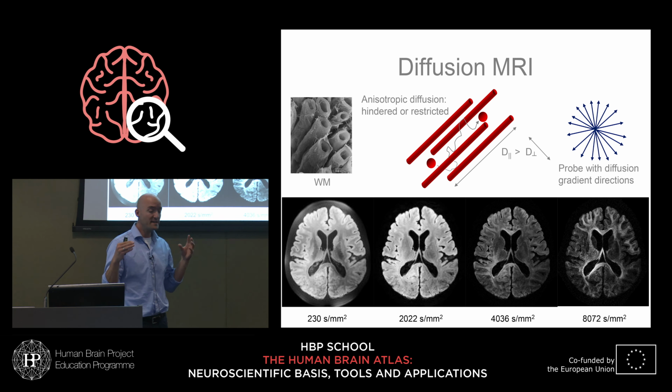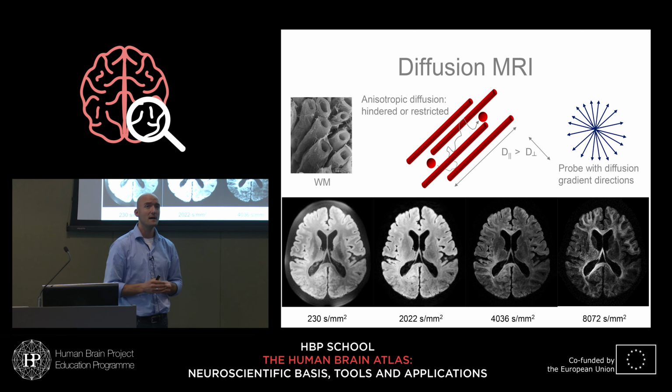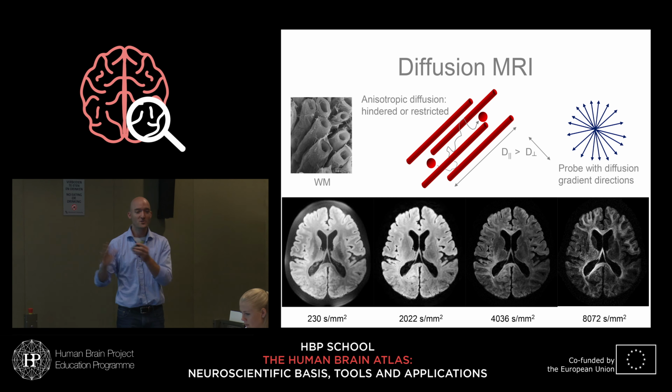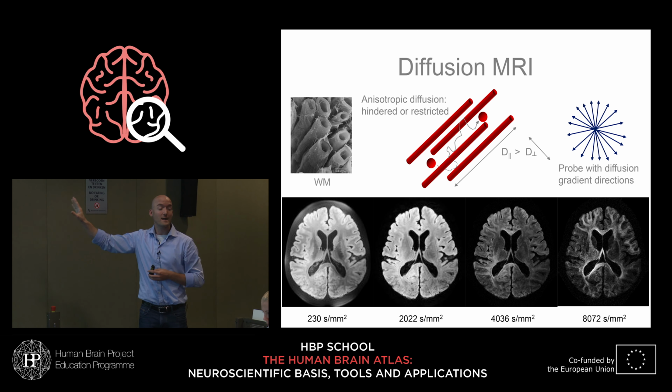However, on whole human brains, we don't do this for 2 reasons. One is, it was already difficult to fix them. It is just as challenging, or perhaps even more challenging, to then assume that you can wash out all of the formalin down to the middle of the brain and have it completely rehydrated again. And second, and very importantly, the anatomists you tend to work with say, oh no, this brain is staying in formalin. This is my precious sample. I'm going to dedicate 20,000 man-hours to this. You are not taking this out of formalin, because after you've done your scanning, which is all good and fine, I want to do my sections and my PLI or my cytostains or whatever. And so on whole human brains, we have to live with that quarter of signal, which is really bad. I will get to occipital lobes later, where we can play the game a little bit differently.